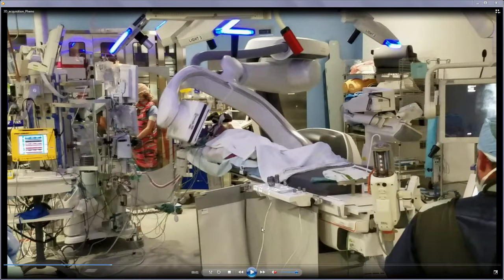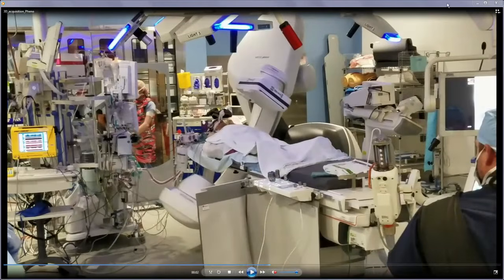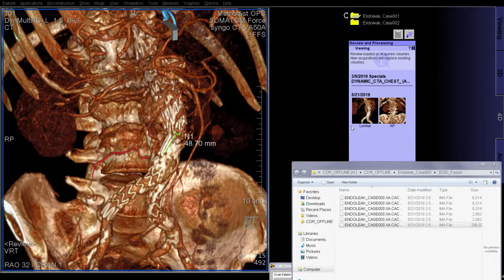Okay, so the concept then is that we got a lot of information on that beautifully acquired dynamic CT. We want to be able to take that image and overlay it on top of the patient, so the image is fused, and we use that C-arm, which is the new Pheno from Siemens, to create a 3-dimensional data set. I call it the quick and dirty scan of the patient on the table. They've not been given any dye. What we're going to do is bring in the previously acquired data set and fuse these together.